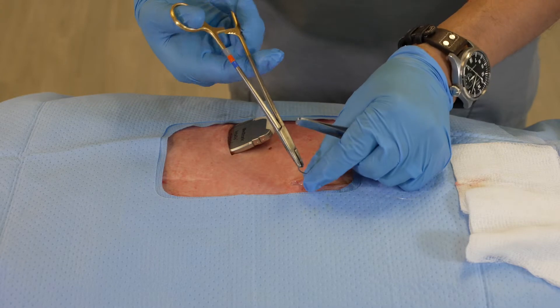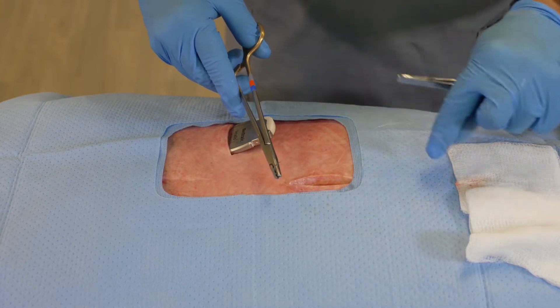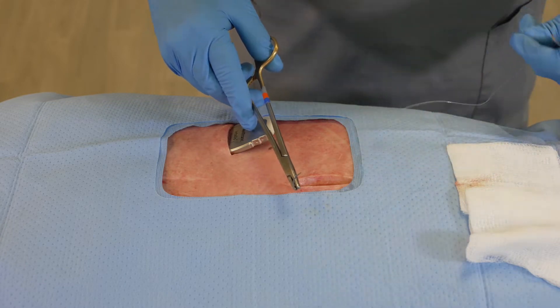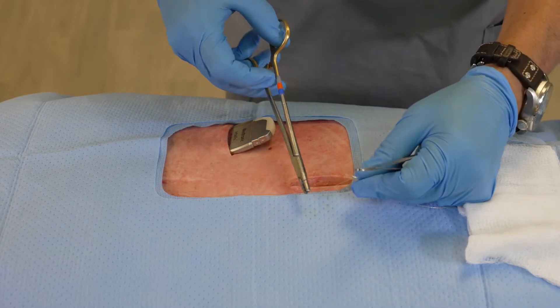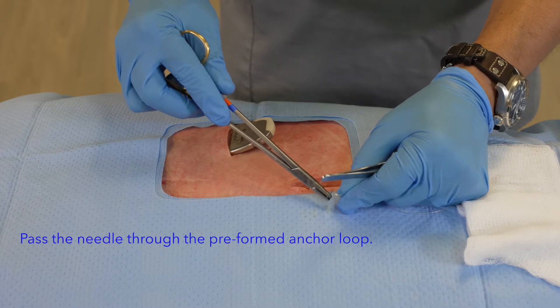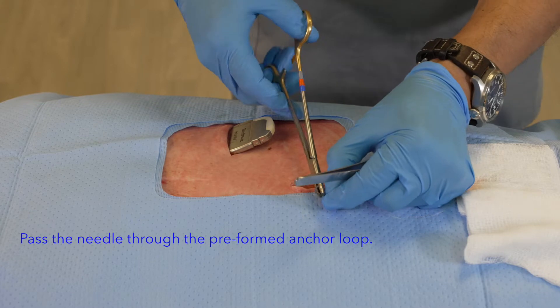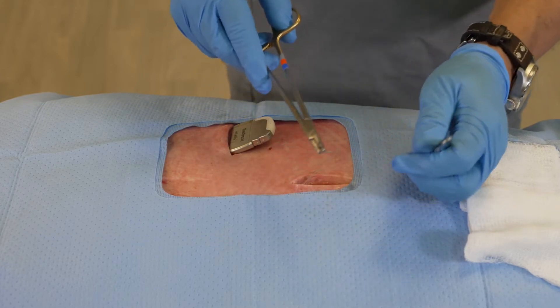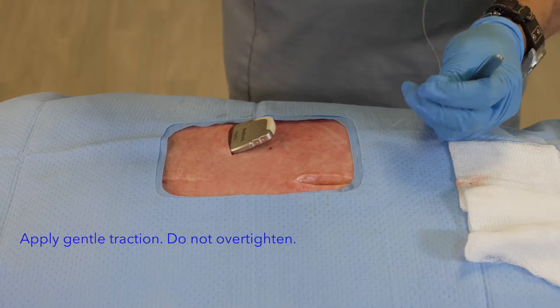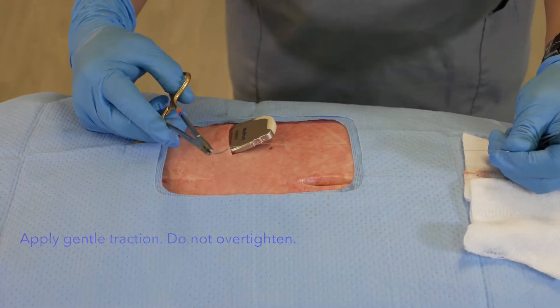Once I've done that, I'm going to take my needle — the very back end of this suture has a small loop that allows me to place the needle within that loop — and then I'm able to bring this down so that it locks nice and firm.